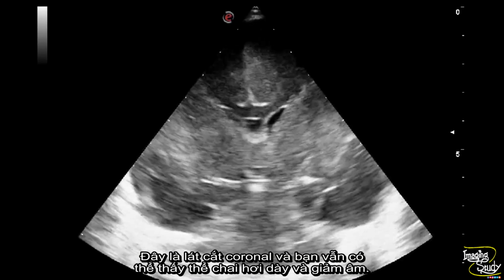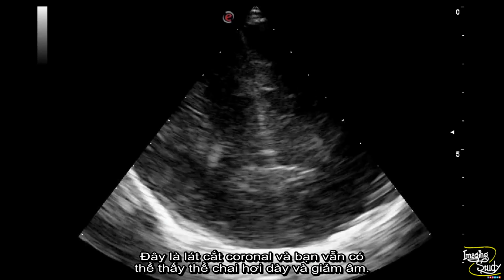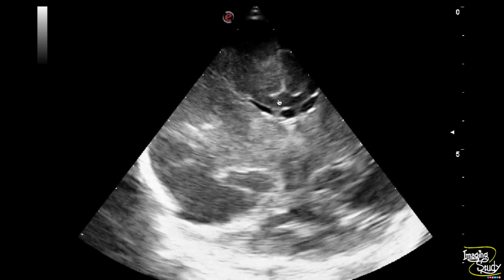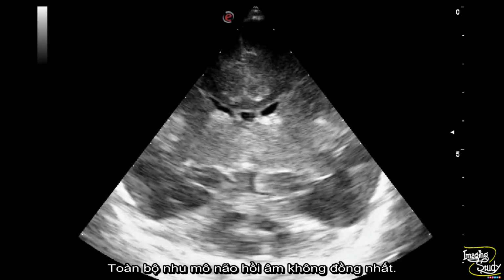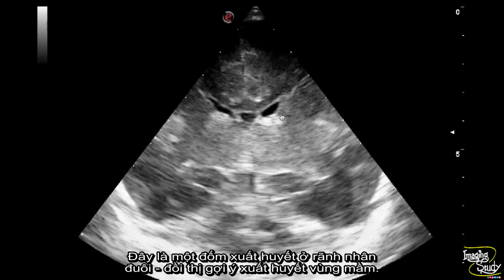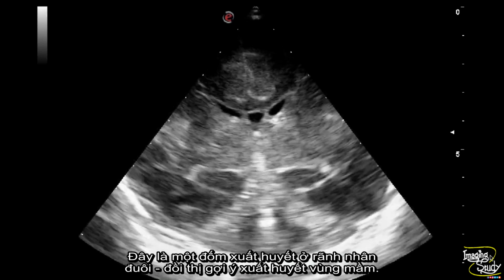So we did a coronal section here, and you still can see the corpus callosum is slightly thickened and hypoechoic. The overall brain parenchymal echogenicity is heterogeneous. There is a spot of hemorrhage at the caudothalamic groove indicating germinal matrix hemorrhage.